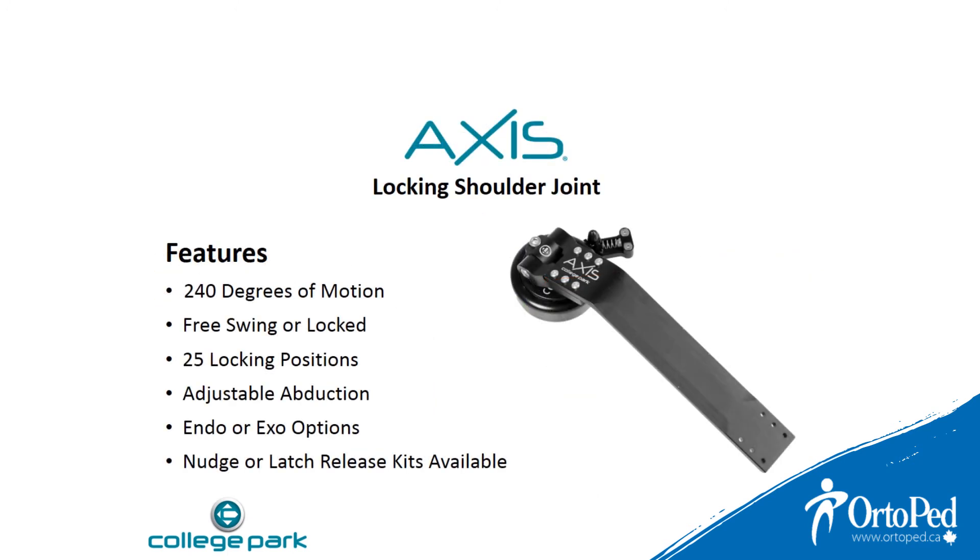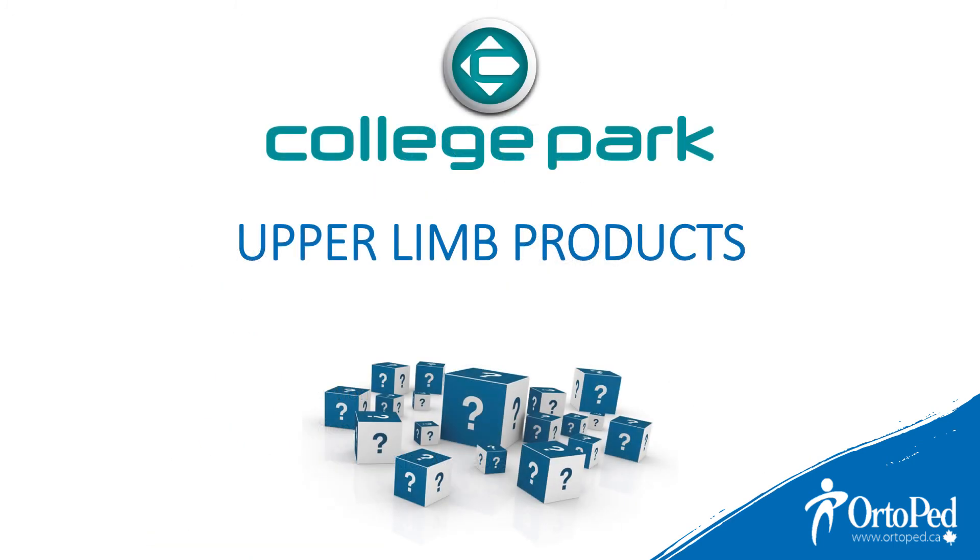Now let's recap the features of the Axis locking shoulder joint: 240 degrees of motion, free swing or locked, 25 locking positions, adjustable abduction, endo or exoskeletal options available, and nudge or latch release kits available as well. Thank you.